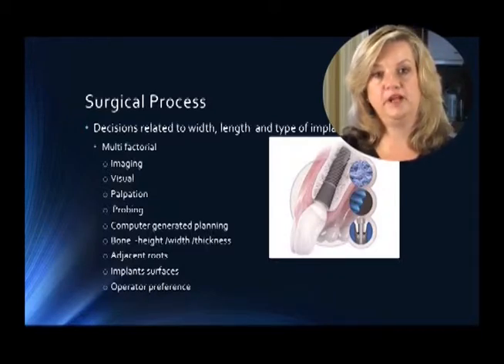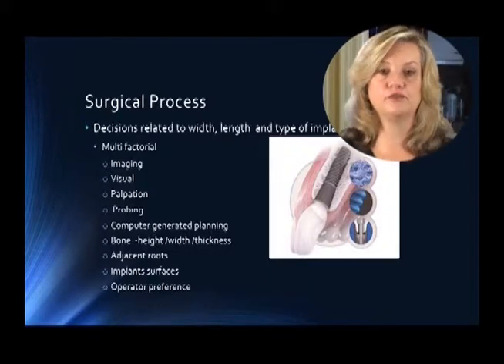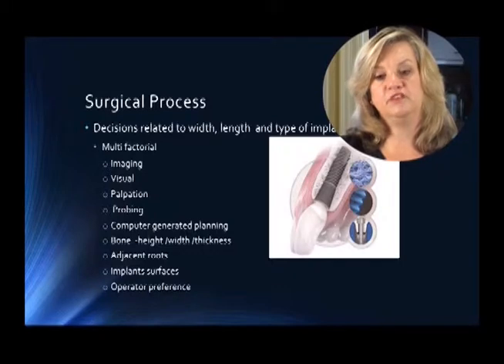Of course, evaluating the bone in terms of height, width, and thickness. The adjacent roots have to be kept in mind. And like I was saying, in the manufacturing of it, there are different types of surfaces involved. And of course, there's good old operator preference, because we feel very close to some instruments and not so warm and fuzzy with others.